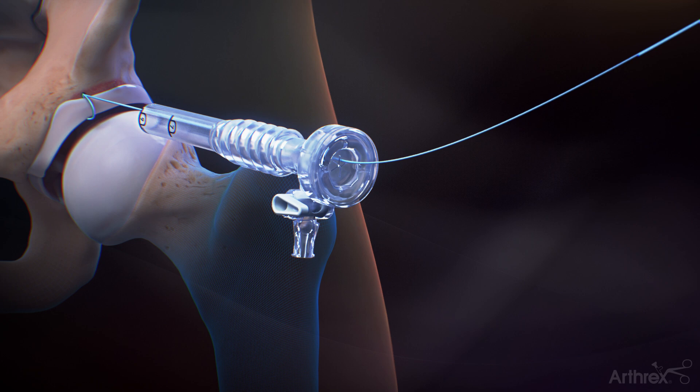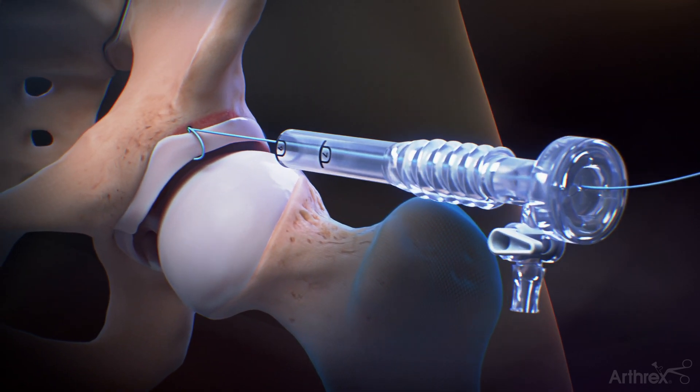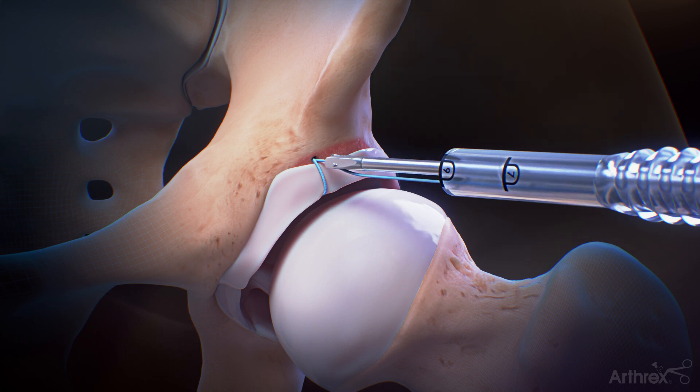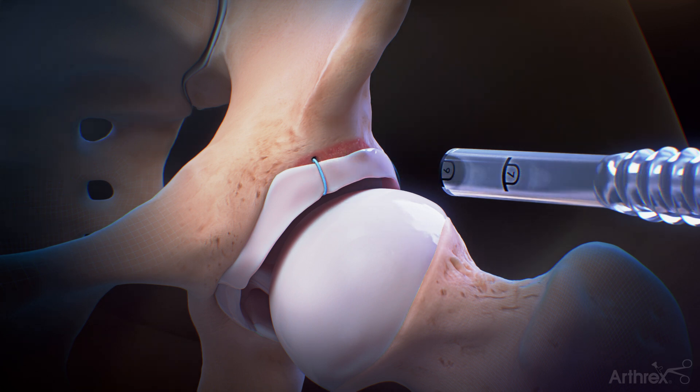Pull the repair suture to the desired tension. Use a mini suture cutter to cut the suture flush with the bone. Insert subsequent anchors as needed to complete the labral repair.